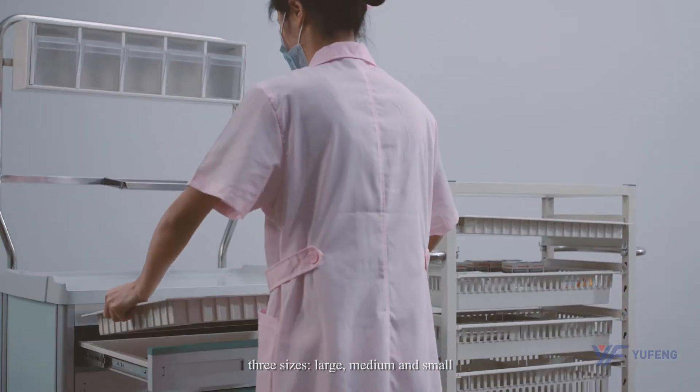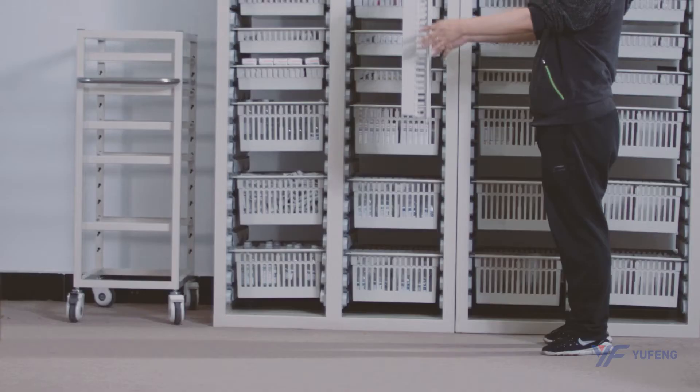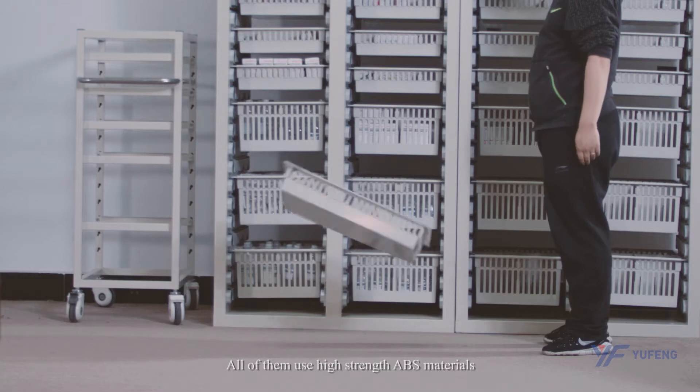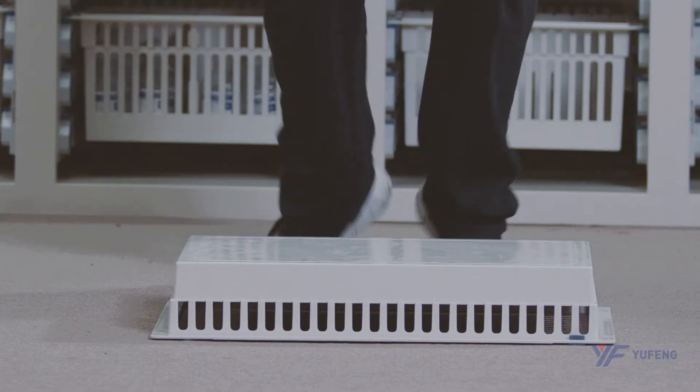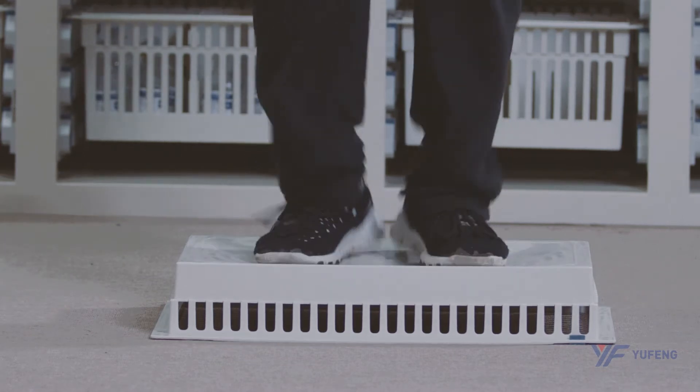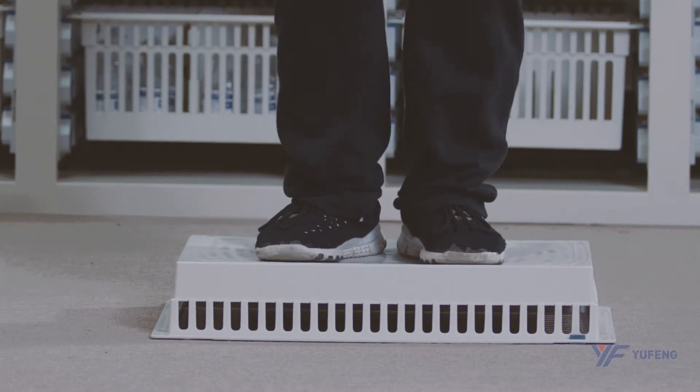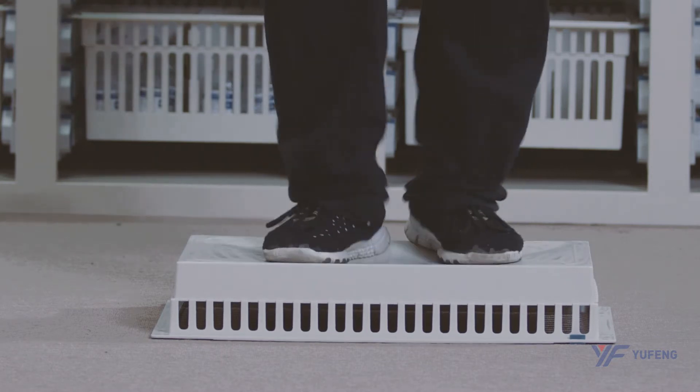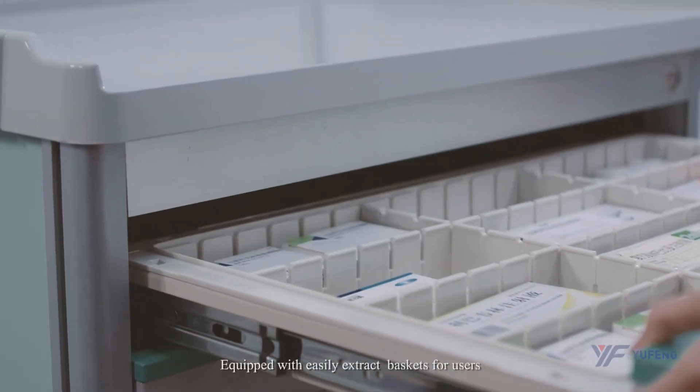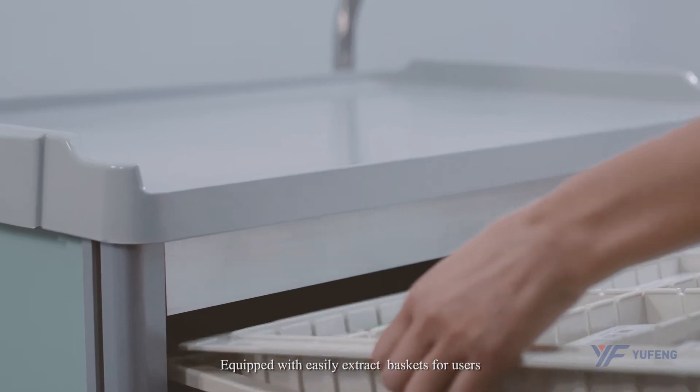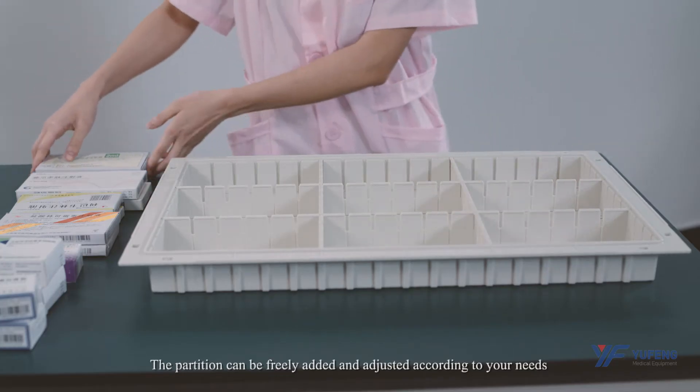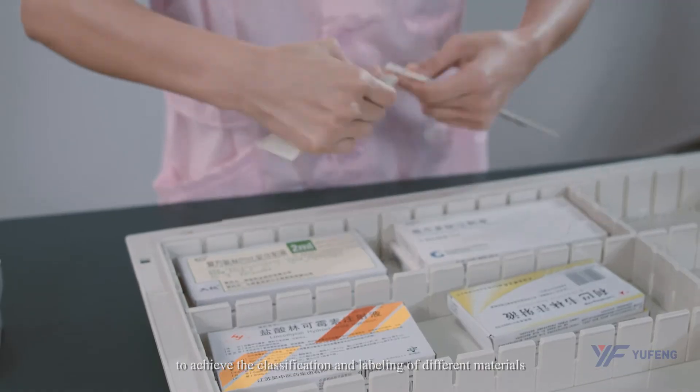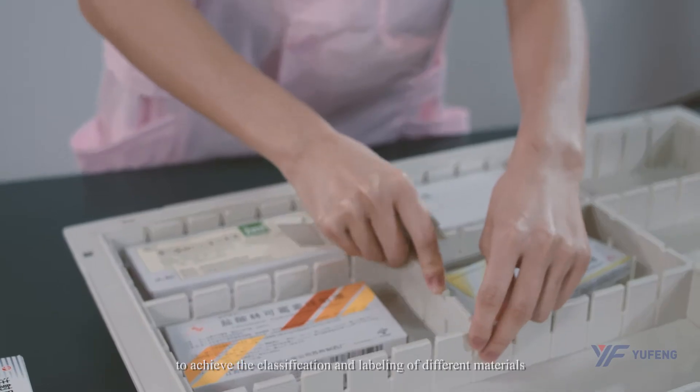into three sizes: large, medium, and small. All of them use high-strength ABS materials and are equipped with easily extracted baskets. The partitions can be freely added and adjusted according to your needs to achieve classification and labeling of different materials.